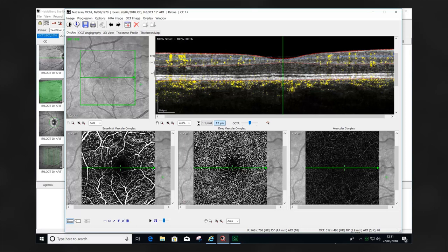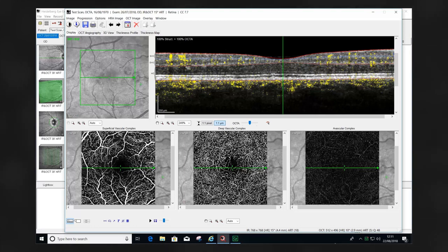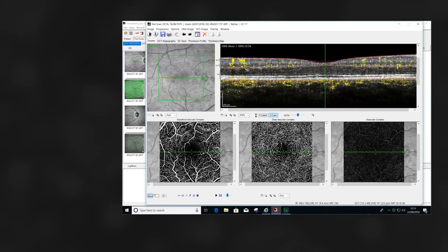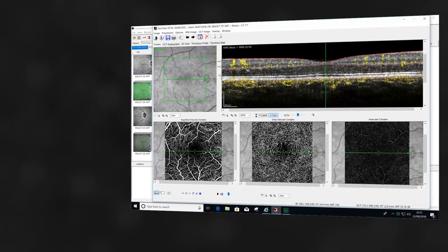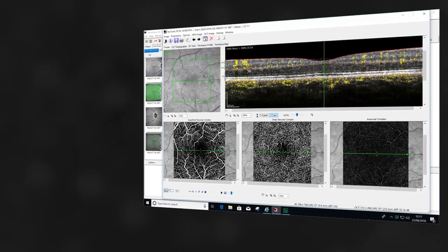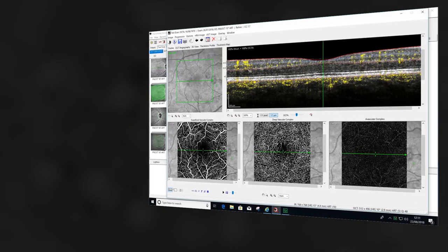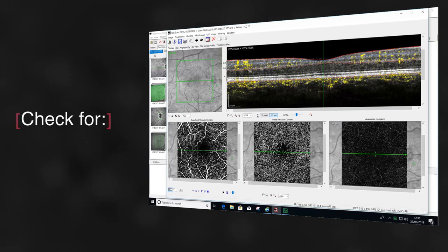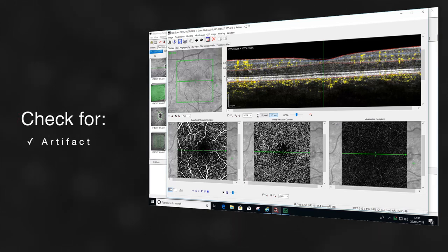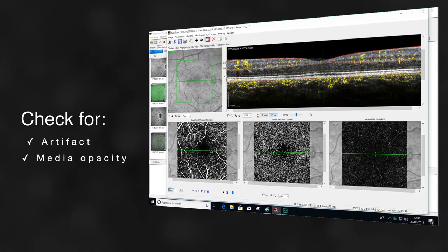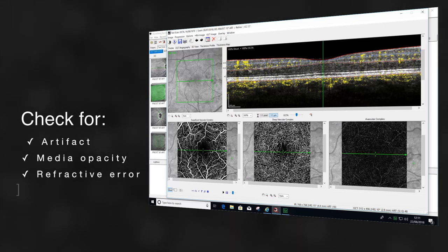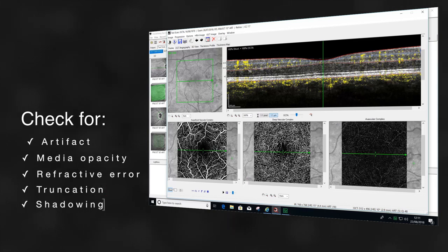Before reviewing and analyzing OCTA images, the images should be checked for quality. In the same way that we would review conventional OCT fundus images or angiographic images for artifact, we need to do the same with OCTA images. We should be identifying is there any evidence of media opacity, large refractive error which may cause distortion of the images, and evidence of truncation or shadowing which may be caused by vitreous floaters or media opacity.